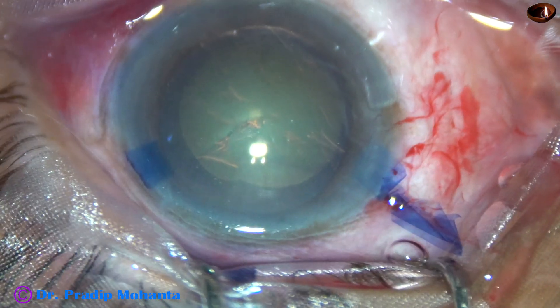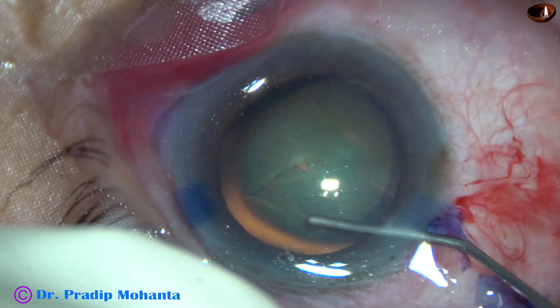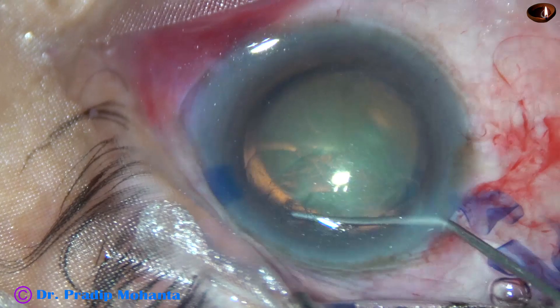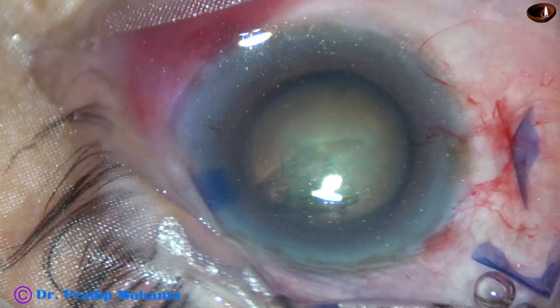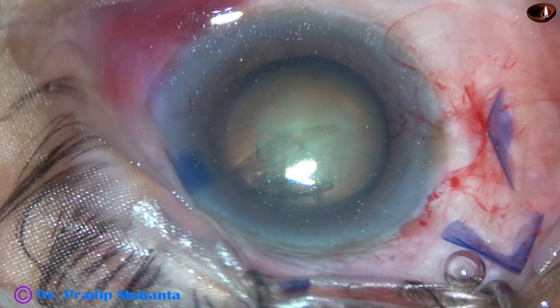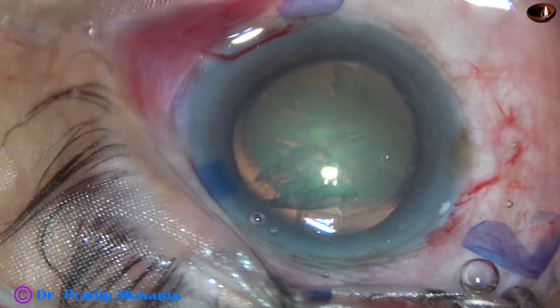And now hydrodissection. A 27-gauge cannula and BSS is used to do hydrodissection. You can see some fluid collection over the ocular surface, which indicates this is a deep-seated eye.